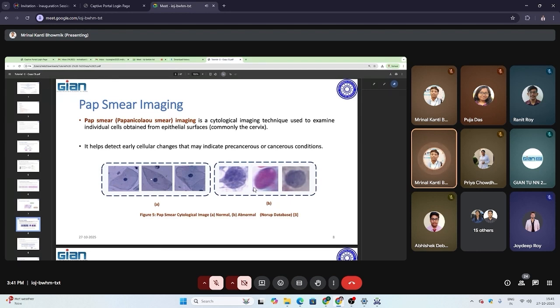Same as this, that is the regular shaped nucleus, and the surrounding is called the cytoplasm. But compared to the normal data, if you see my cursor, the nucleus is spread, overspread. And this is the shape of the precancerous or the cancerous condition.